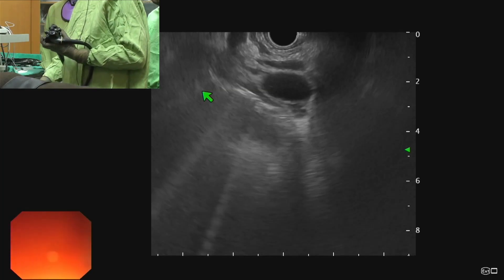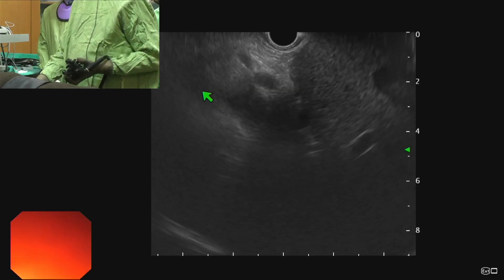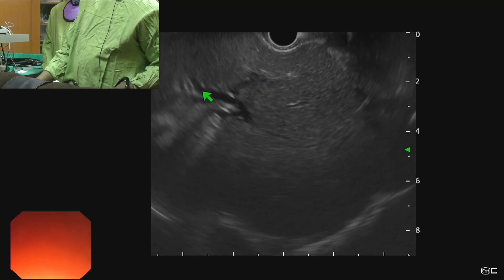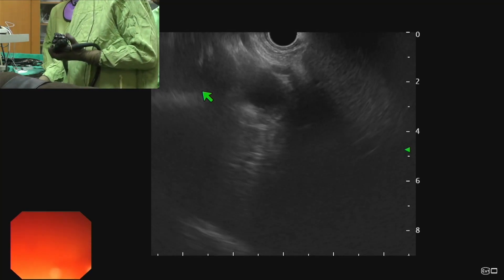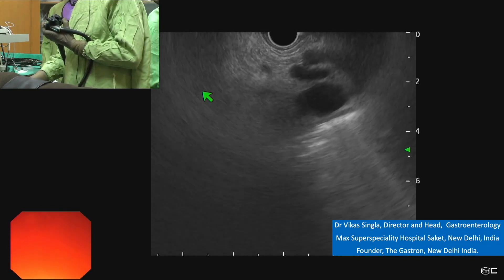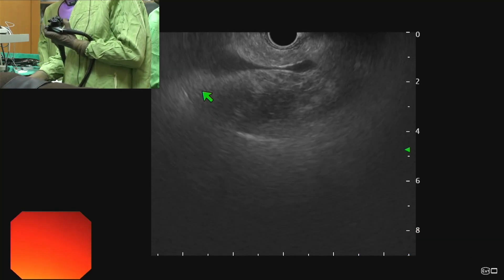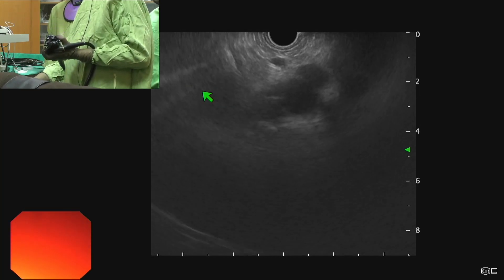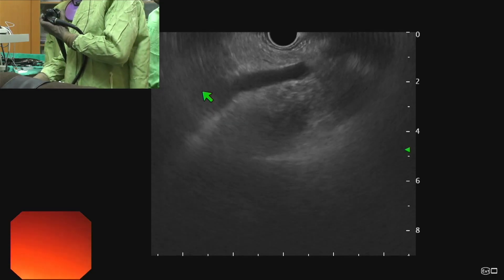The CBD can be traced inside the liver by pulling back with a slightly left side torque. We can see the left-sided radicles which are dilated. Then with clockwise torque and push, we can face the lower CBD. Here we can see intrapancreatic CBD. The CBD is below the portal vein, it's dilated, and we don't see any stone here.